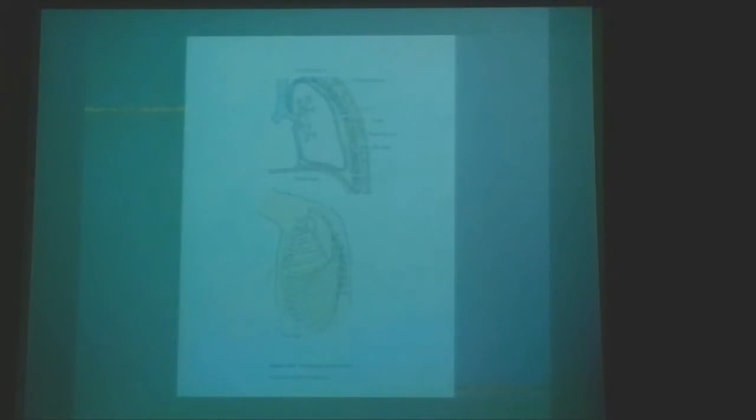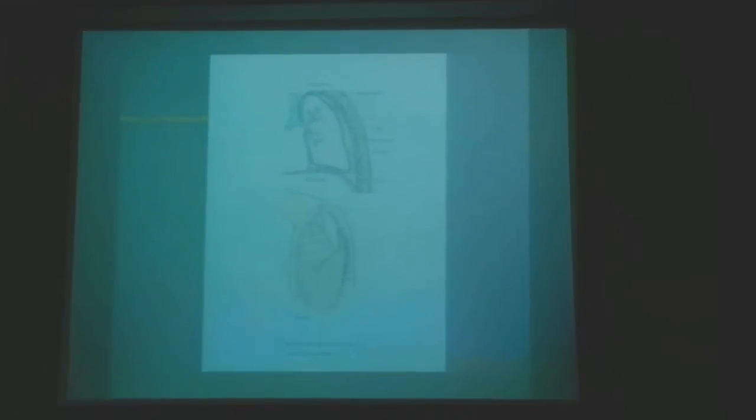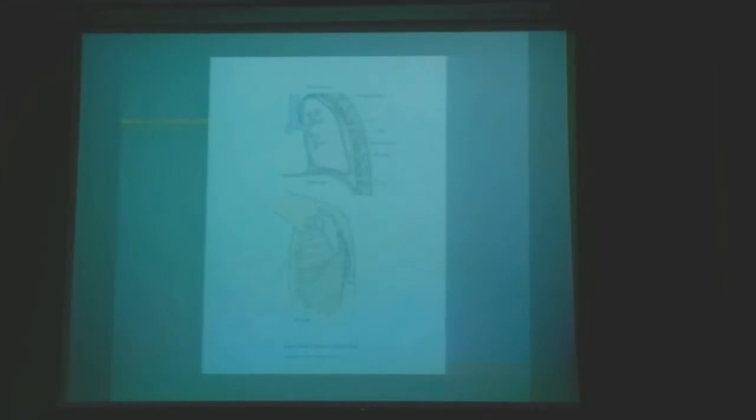This is what we are talking about. Did you see here? Okay, this is the trachea. This is the line. What is the name of this layer? Visceral pleura, right? What is the name of this layer? Parietal pleura. So those layers have to be intact all the time. Okay? If there is a space between them, there is no negative pressure. So this is the tube here for the air, and this is the tube for the basal one, for fluid, rather than pneumothorax, or pus.